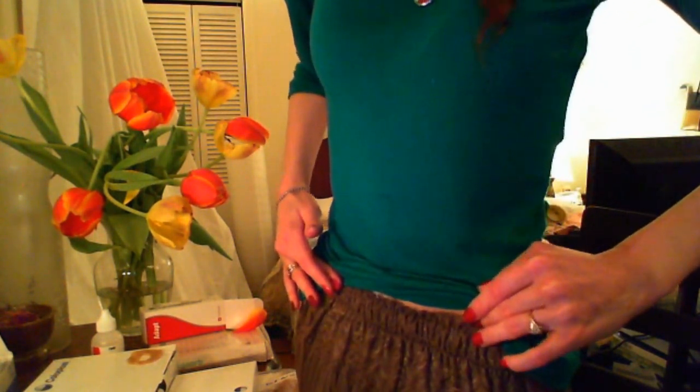Now me, because I do not like this flap, I tend to fold it down. And I have a little holder that I've made. I shall show you, since you are dealing with this too. Now for women, it may be a bit easier to accommodate having an ileostomy, because we can wear our skirts up above it. I will show. So here is the edge of my skirt. And here's the edge of my ileostomy bag. And you can fold it up like that, but I like to keep it folded down. And then you can wear your skirt right there above it.